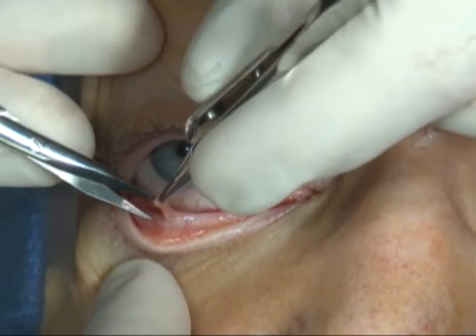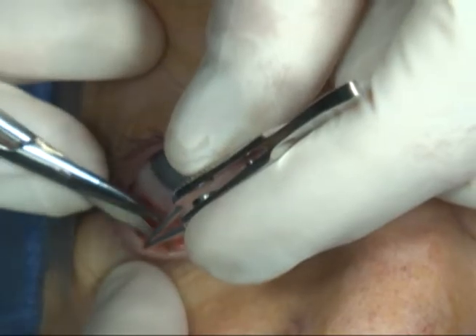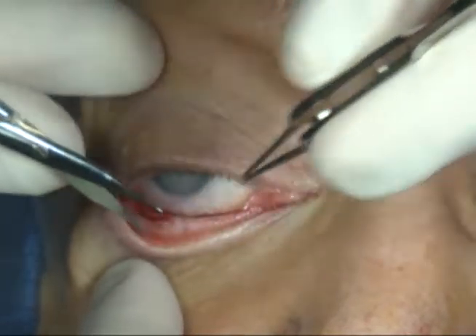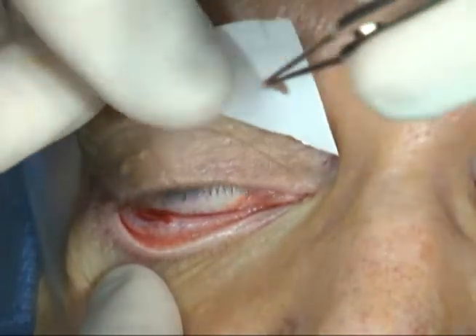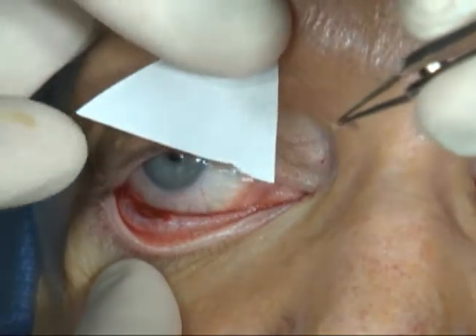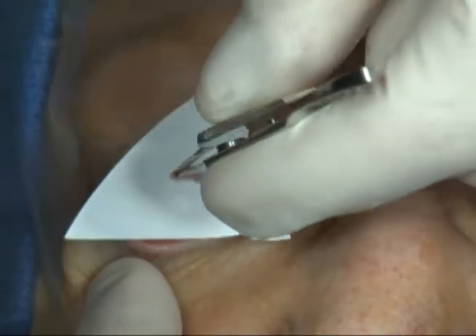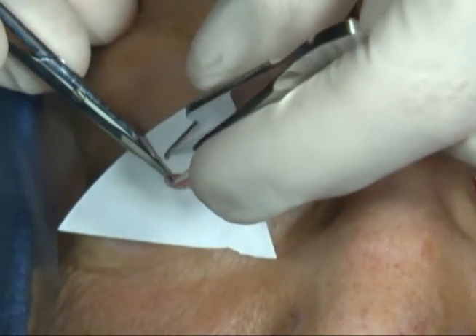This biopsy can be taken with tooth forceps and Westcott scissors. The specimen is then placed on filter paper so that it remains flat, with the orientation of the specimen with the epithelium up.